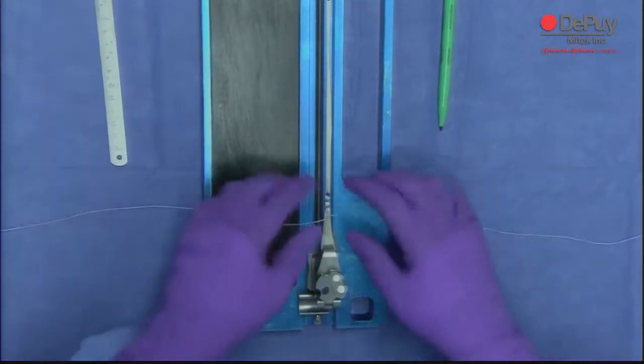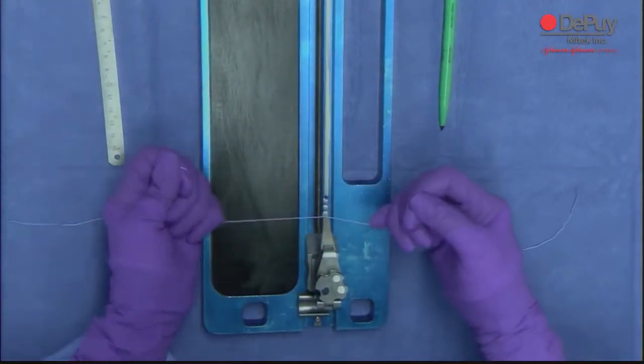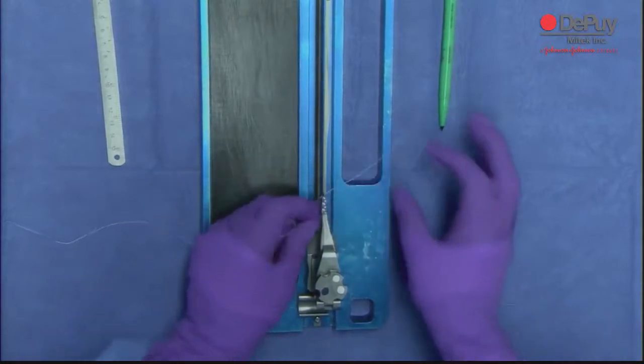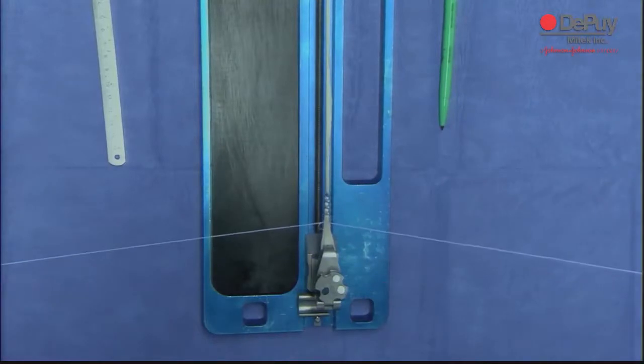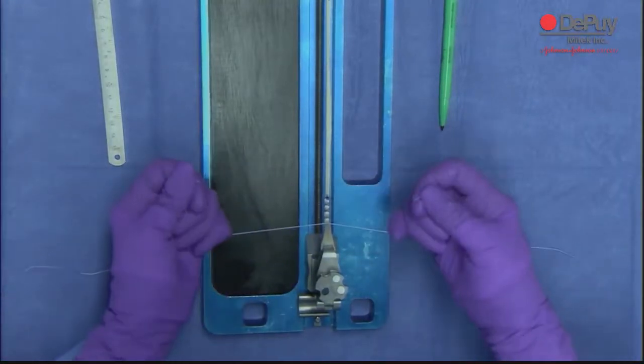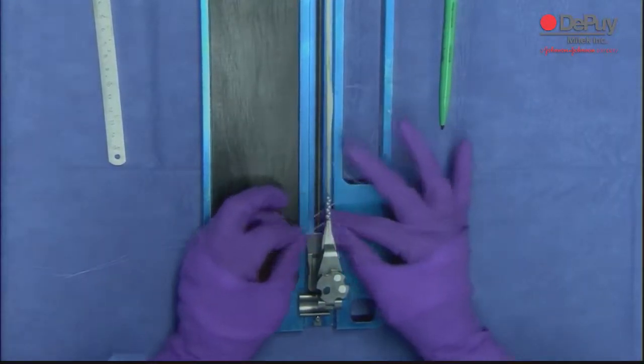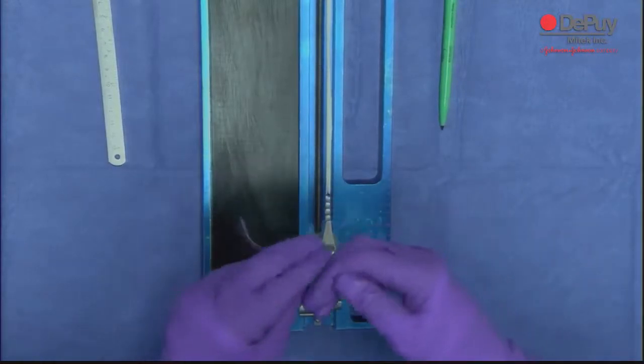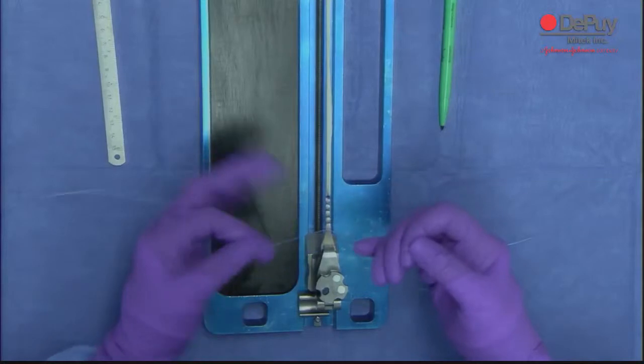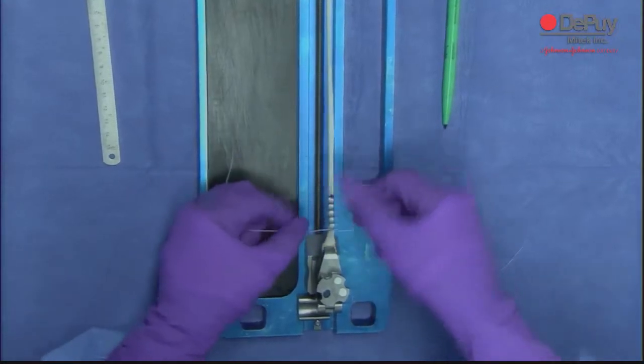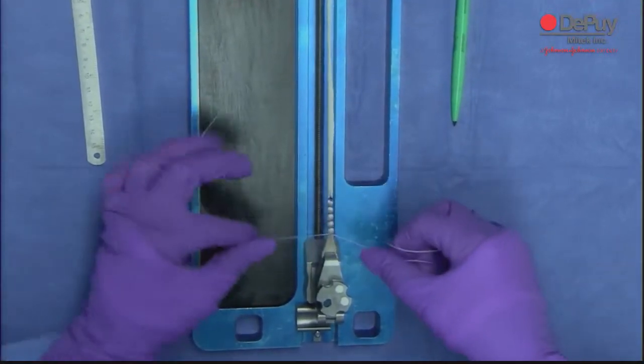What I do is space the sutures about five millimeters apart, and I do six knots. That was the fifth, now is the sixth. You want to leave this five millimeters apart because you want to leave this tissue out so the graft will heal into bone.